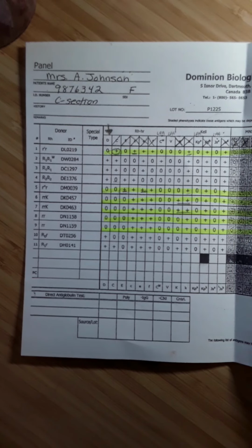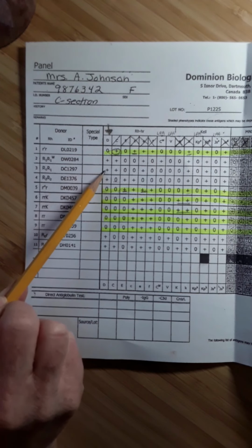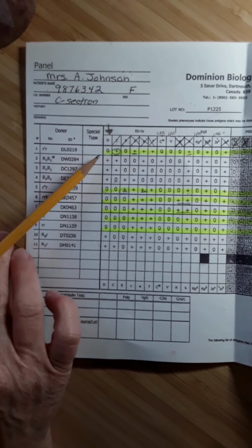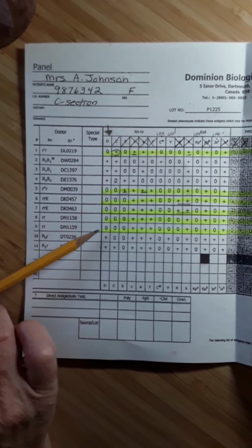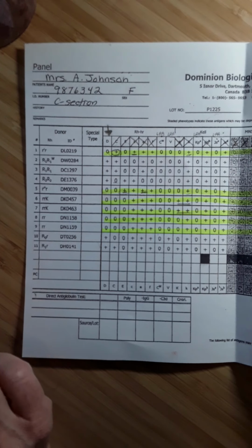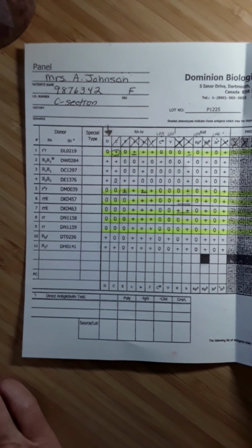And we have at least that because we've got 1, 2, 3, 4, 5 D positive cells that did react and 1, 2, 3, 4, 5, 6 D negative cells that did not react. And really, I can also count the panel cells that did and did not react as well. So I've got at least 3 panel cells that react, D positive cells that reacted, and at least 3 D negative cells that did not react. And that will give me actually 95% confidence.